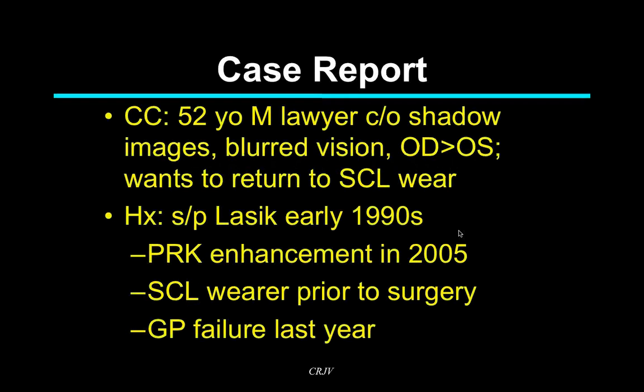All right, moving along. The next case report. A 52-year-old male lawyer presents complaining of shadow images and blurred vision, right greater than left. He wants to return to soft contact lens wear. He has a history of having had LASIK surgery, first in the 1990s. I saw this guy yesterday.